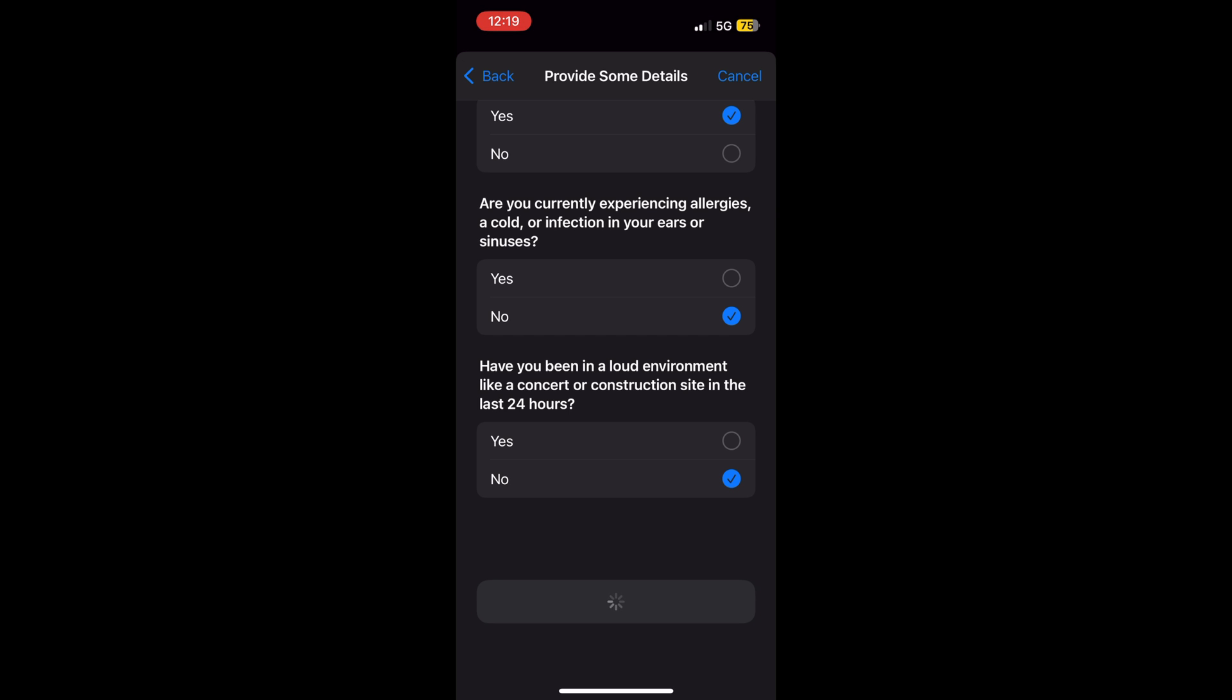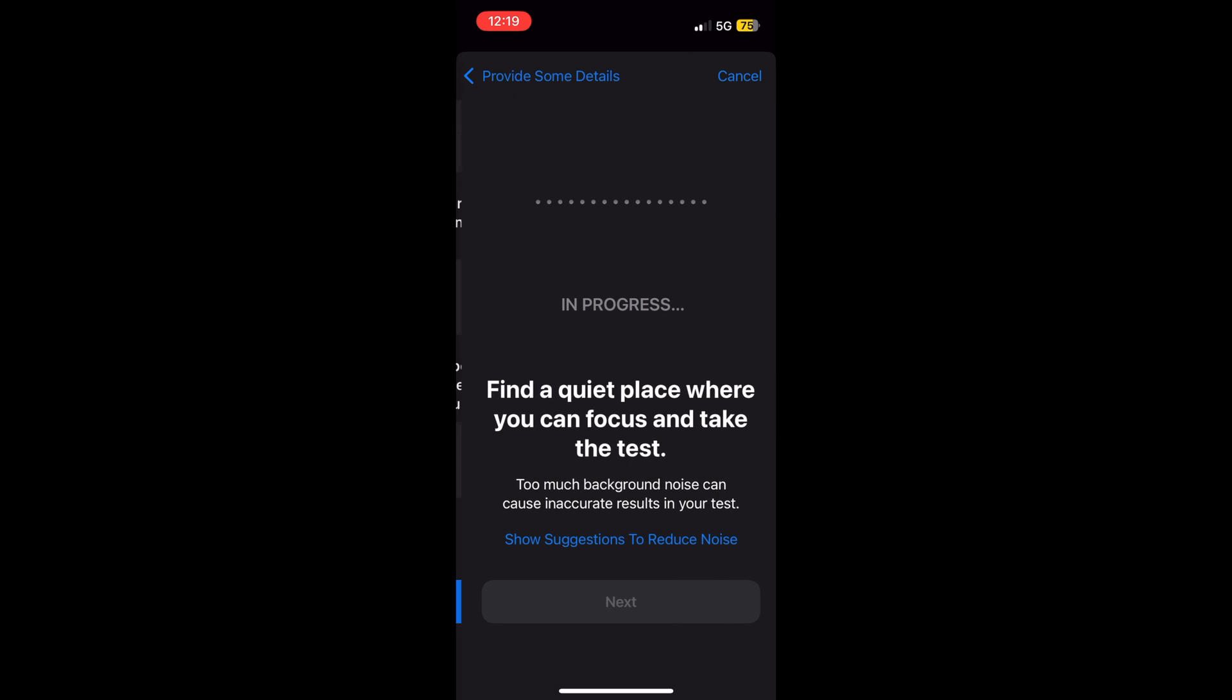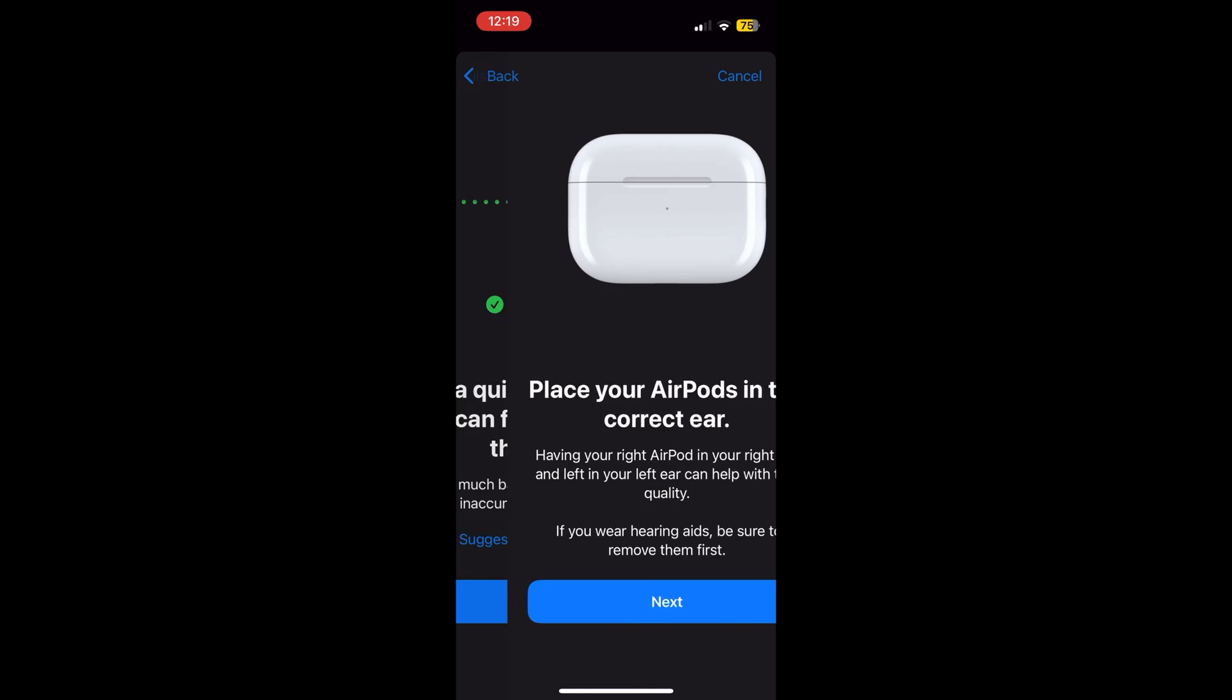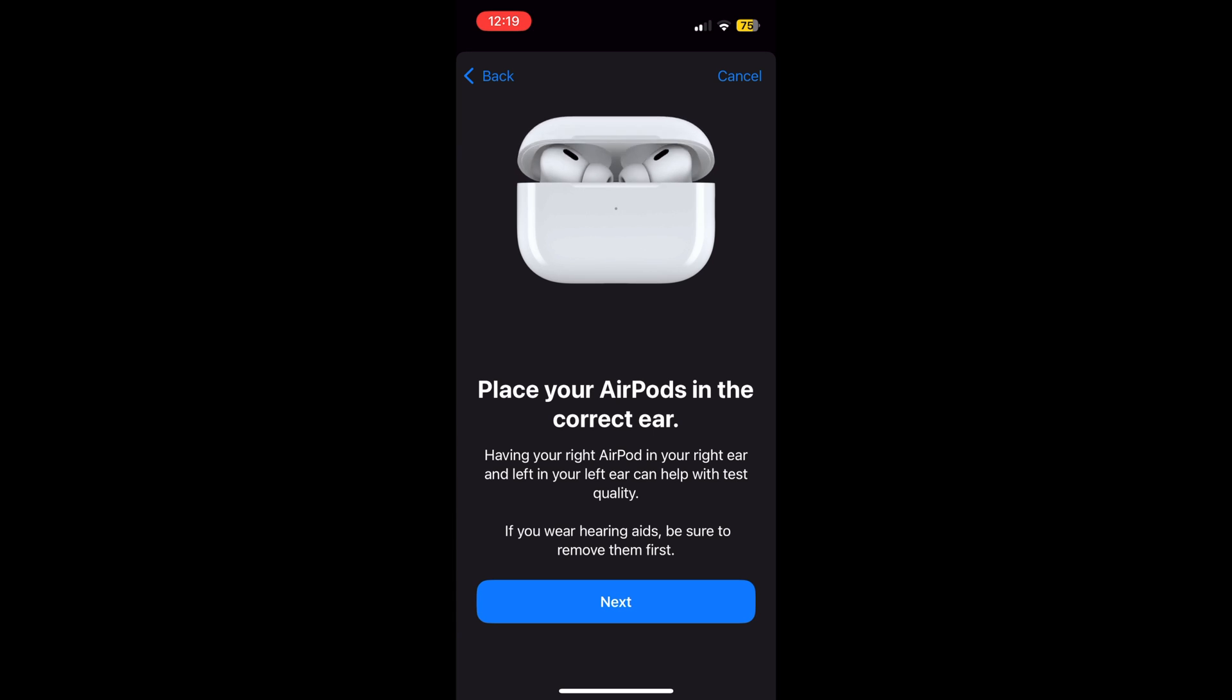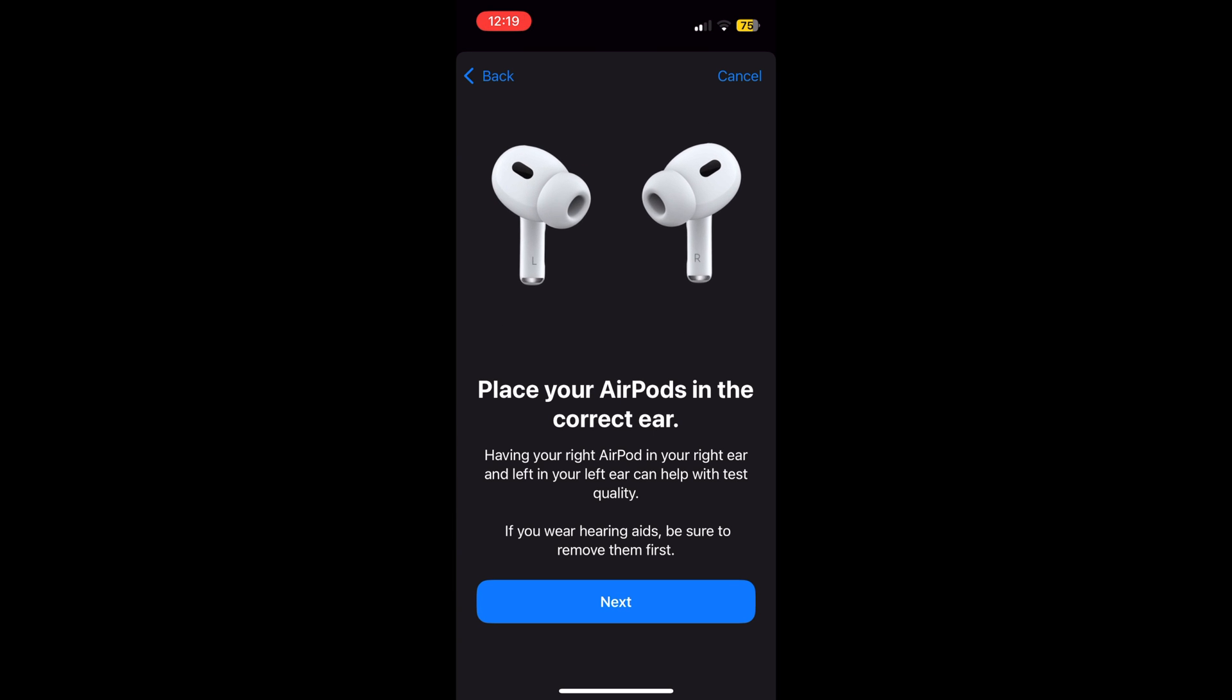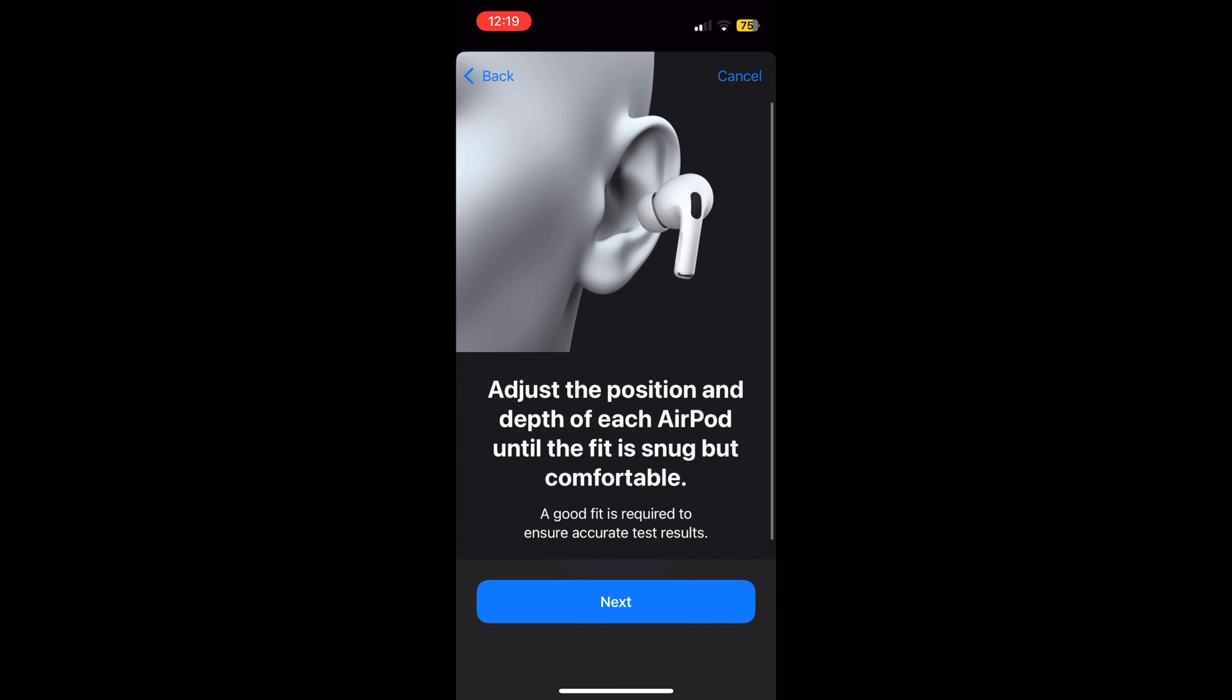For those concerned about noise exposure, hearing protection mode monitors and limits exposure to loud environments. Though this feature is initially available only in the US and Canada, these features require AirPods Pro 2 firmware version 7B19 or higher.